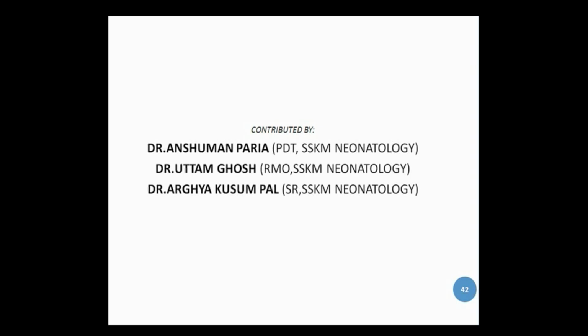Remember to change the infusion sets every day. It is better if you use another line for administration of antibiotics and inotropes instead of the line which is being used for total parenteral nutrition.